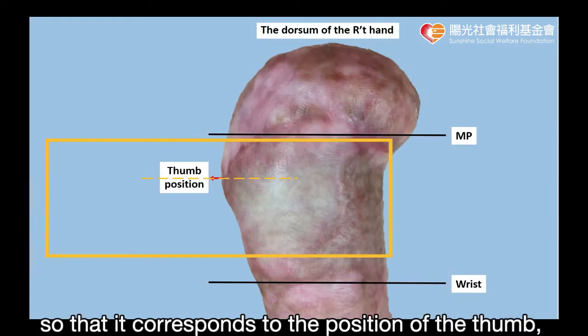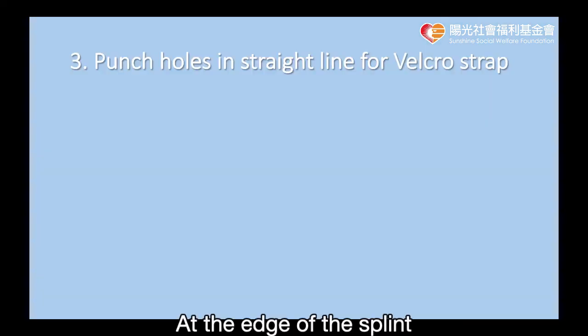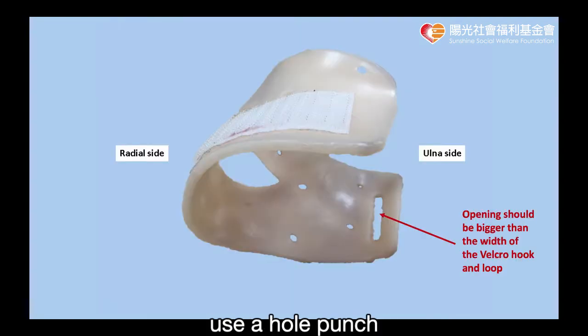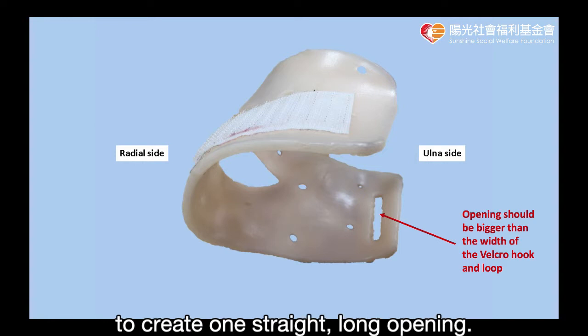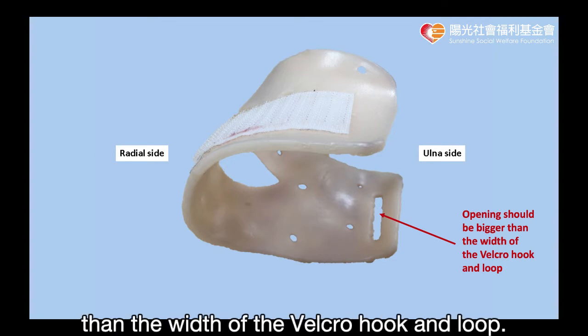After fitting the opening so that it corresponds to the position of the thumb, shape the splint around the patient's hand. At the edge of the splint on the side of the little finger, use a hole punch to make holes in a continuous line to create one straight, long opening. The length of the opening should be bigger than the width of the velcro hook and loop.